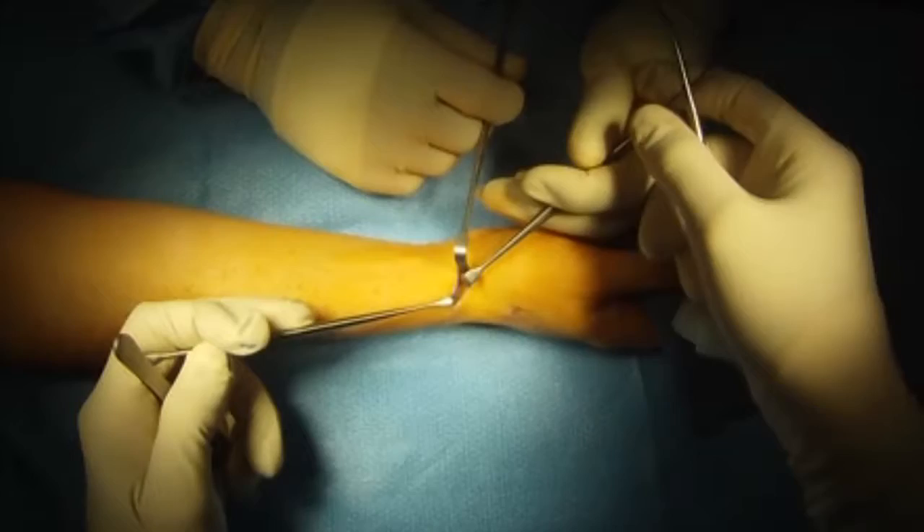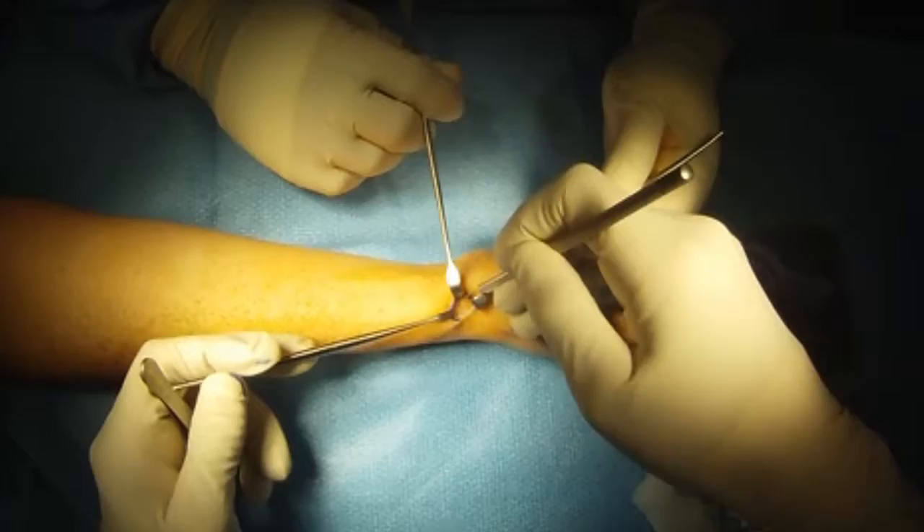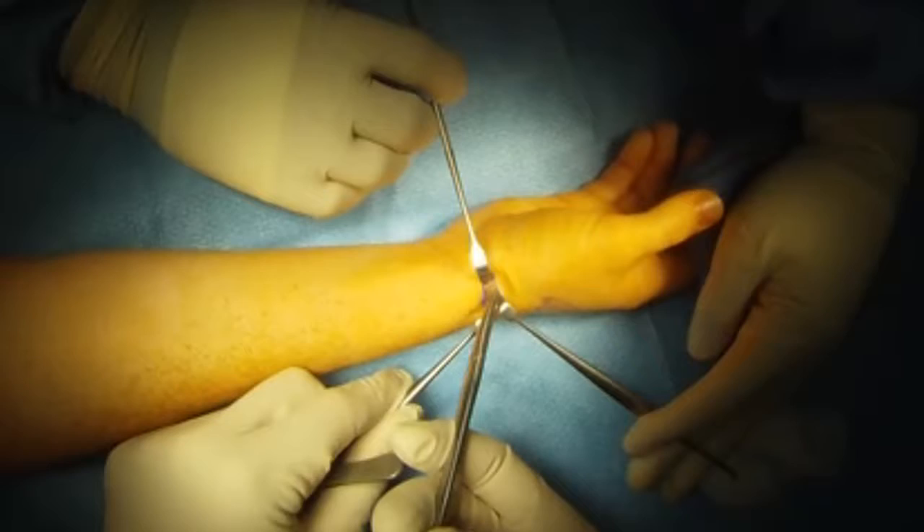Once that's done, I then retract the tendons and I look for a small subsheath where the thumb extensor tendon is. This is a frequent source of problems if overlooked. I then release the subsheath going up the arm, then down towards the thumb.